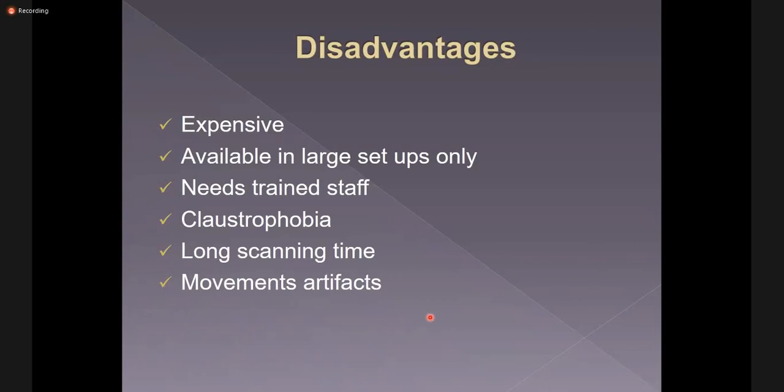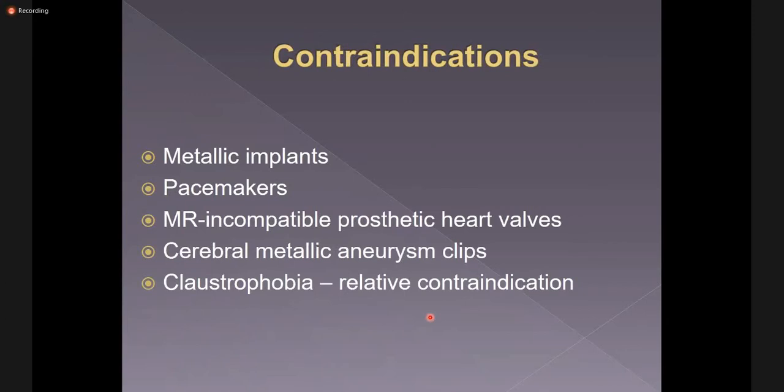Sometimes it can make MRI difficult, especially if the patient is on a ventilator, or cannot enter the MRI room because of cylinders or instrumentation. We cannot take these into the MRI, which has a very high magnetic force. And because of the long scanning time, there may be movement artifact.